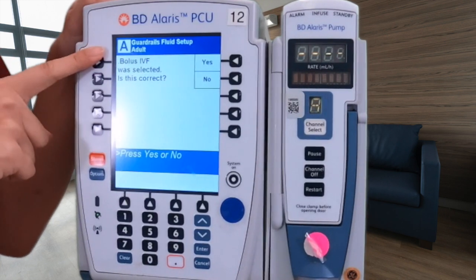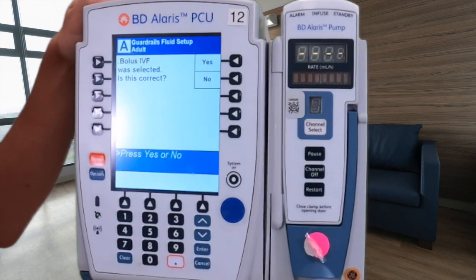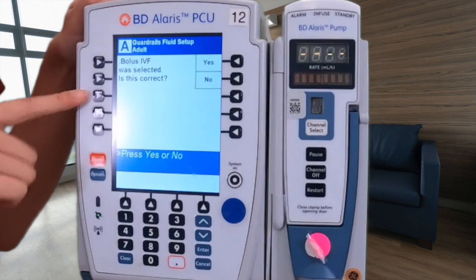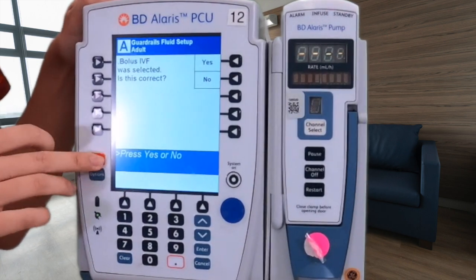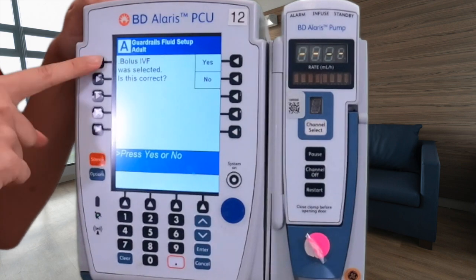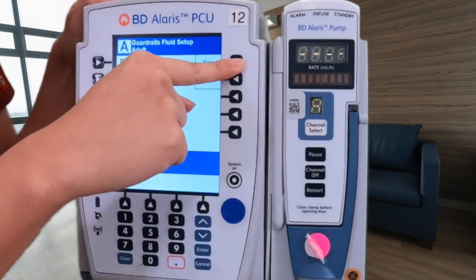We're going to double check our order. Our order states that we have to do a liter bolus with a rate of 999 milliliters an hour. We double checked our order — bolus IVF is what we want, so we're going to click yes.